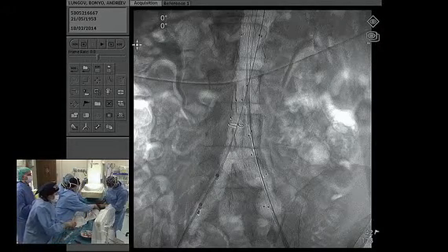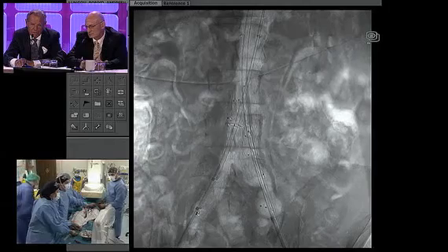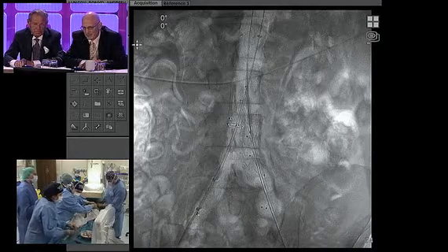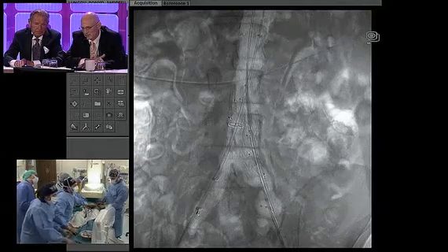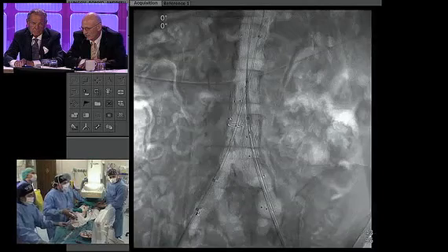Dan, what size diameter of the iliac below the graft would you leave it and be acceptable? And when do you think you have to go down and take some technique to close it? I think this is probably the upper limits of what I would accept. And I think in this situation, because you've preserved the other hypogastric, if you've achieved good seal, you could stop here. But this is obviously something that's going to need to be followed over time. And if you needed to, it could be embolized and extended later or just covered later, depending upon the anatomy.